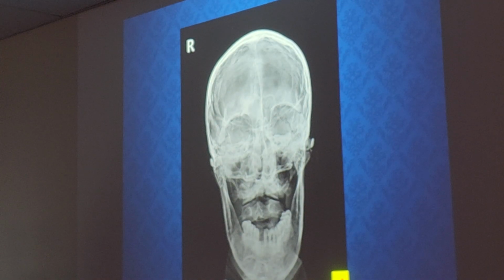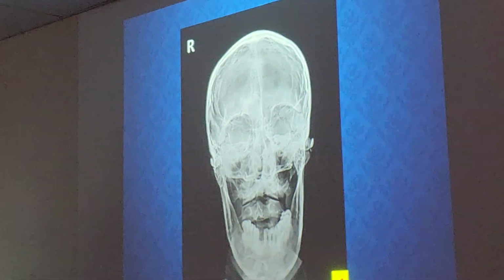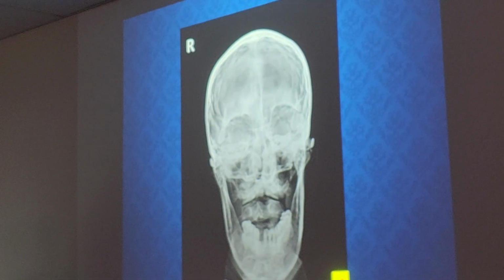Skulls. What projection is this? Open mouth. I said projection, not position. My fault. AP, open mouth. I'm saying PA. Do y'all do your skull PA? I think it's AP. It should be AP.